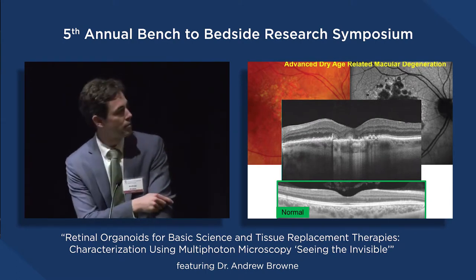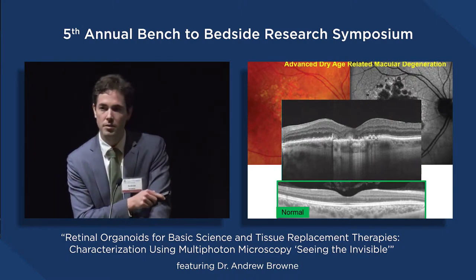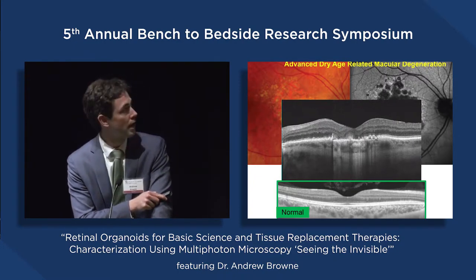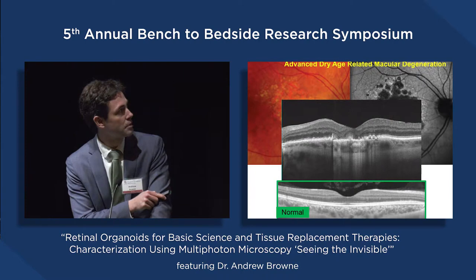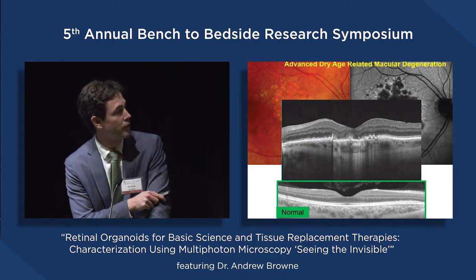They're not blind, they can see things in the periphery, hopefully, but they usually have just lost their central vision. And again, we can compare this to the normal OCT, where you see a nice foundation of the retina here. But the foundation of the retina in age-related macular degeneration in its advanced form is completely lost. The cells that line the foundation are completely absent. The photoreceptors, which are this bottommost layer, they're supposed to be here. They're still present over here, but the photoreceptors are all gone. There's no light being turned into electricity in this area, or very little at least.